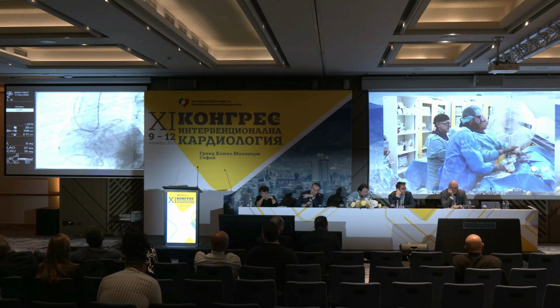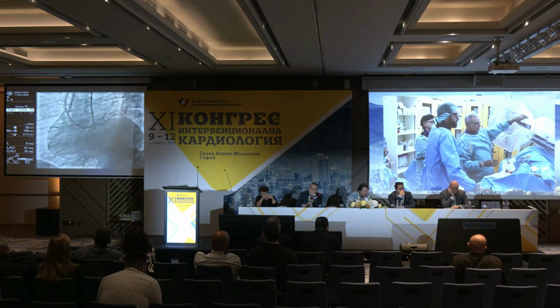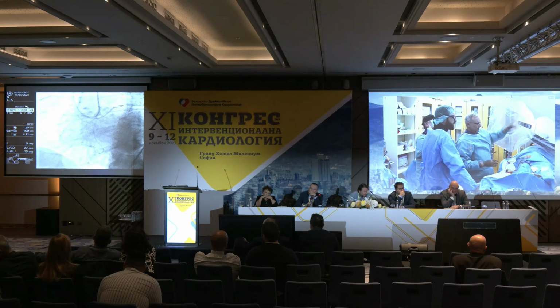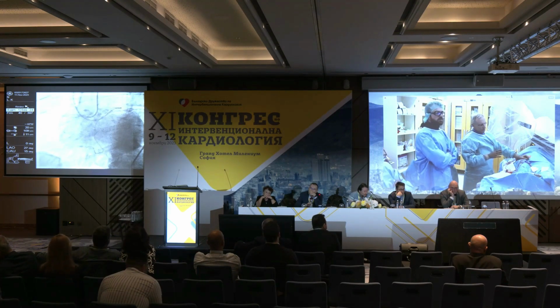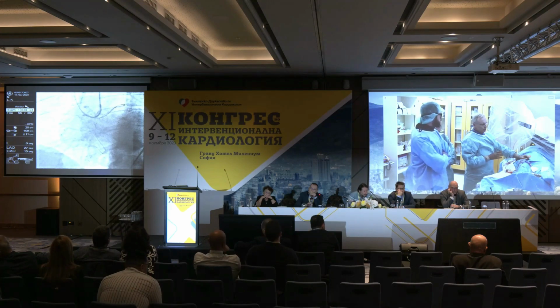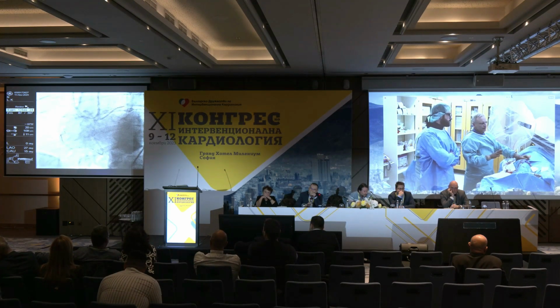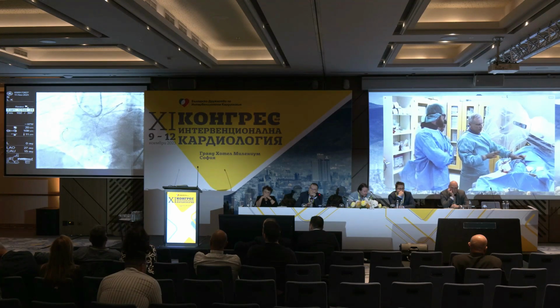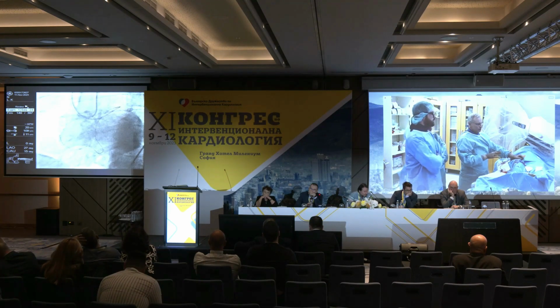Valery? Yeah. George? Okay. What happened is that, as I was expecting, we left you here. It was obvious that with the guy we did good progress in the right direction. When I'm always there, I never rush into complicating life. You have to get the maximum of what the procedure has to offer.